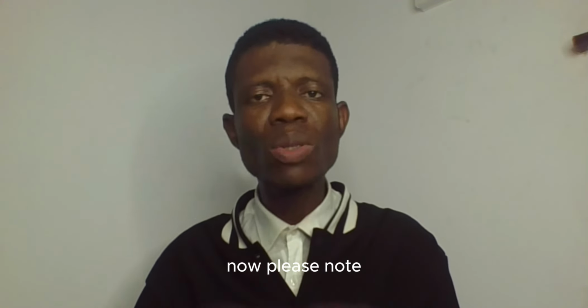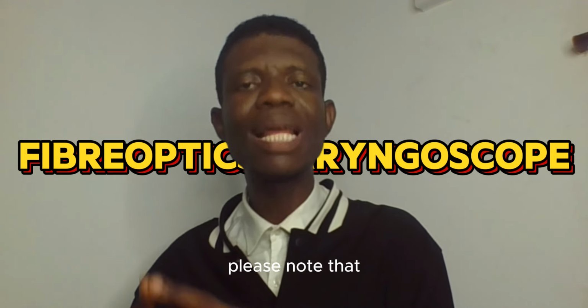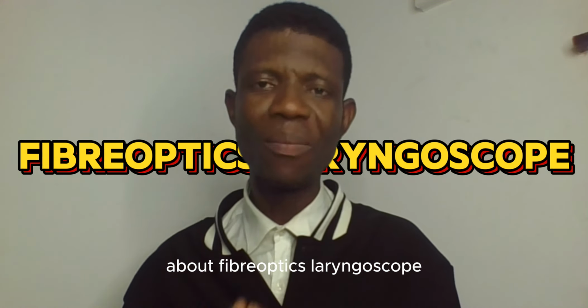Now, please note, this device can be inserted even when the patient is awake or when the patient is sedated. Please note that the device can be inserted either orally or nasally. These are the things that you need to know about fiber optic laryngoscope.